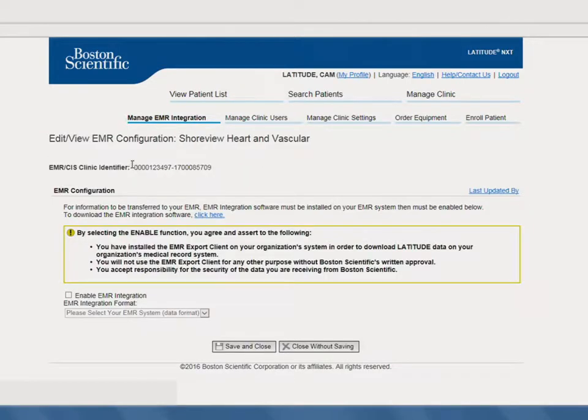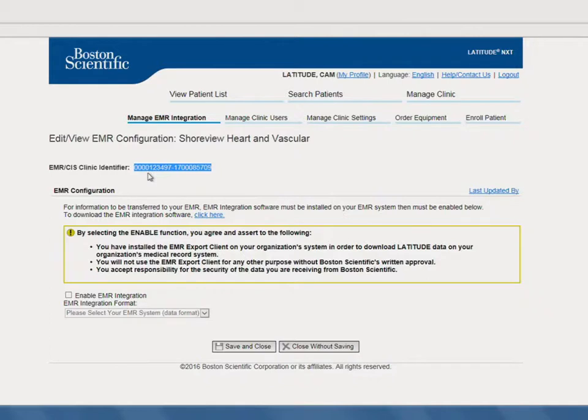It's important to take a moment to document the EMR-CIS clinic identifier shown on this page, as you'll need it to complete the registration process.